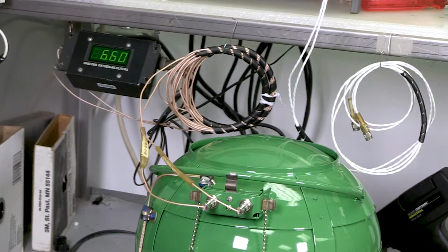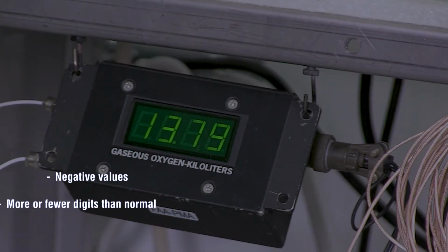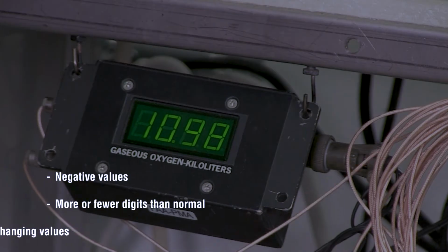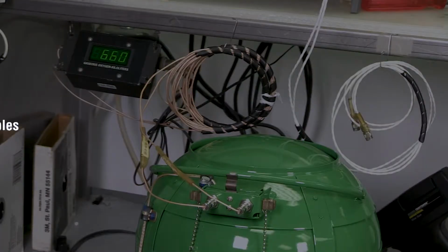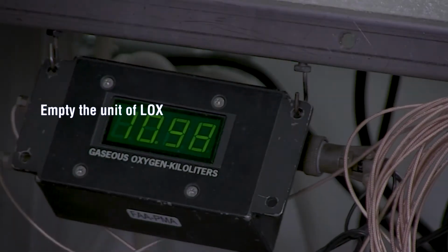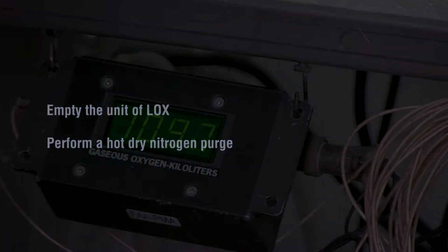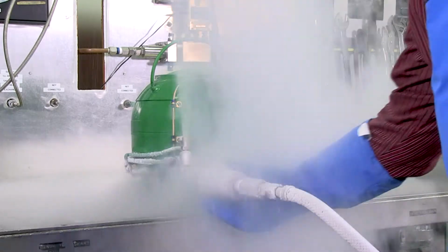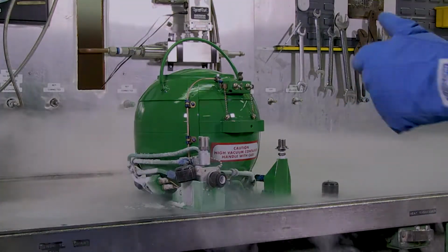The LOX indicator may display negative values, more or fewer digits than normal, or rapidly changing values. To troubleshoot, use spare cables first, if available. If erratic readings still occur, empty the unit of LOX and then perform a hot, dry nitrogen purge on the unit. After the nitrogen purge, refill the unit with LOX to see if the issue has been fixed.